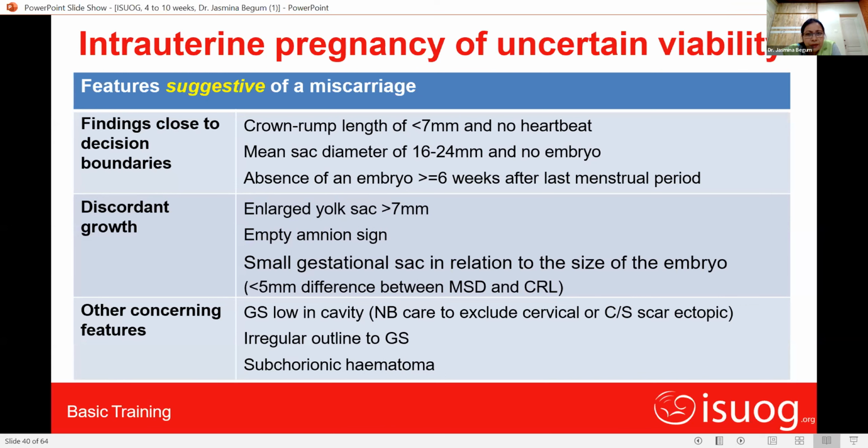By seeing these criteria you can make a diagnosis, but also always ask her to follow up and depend on time-based criteria.